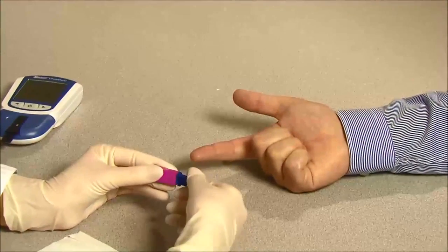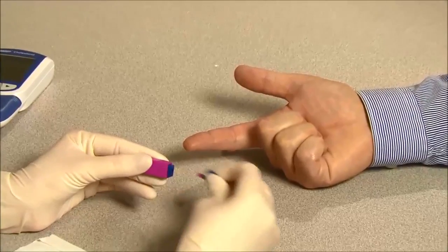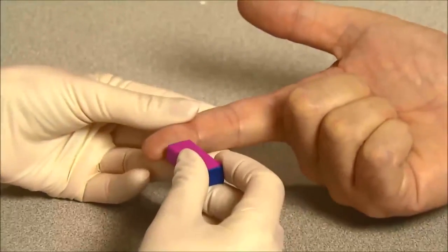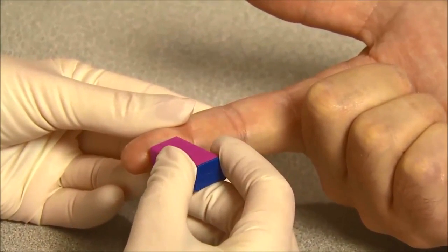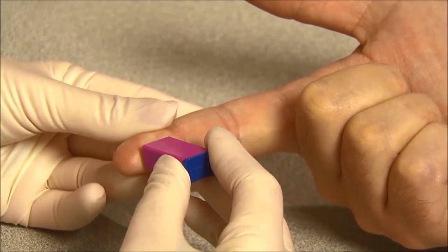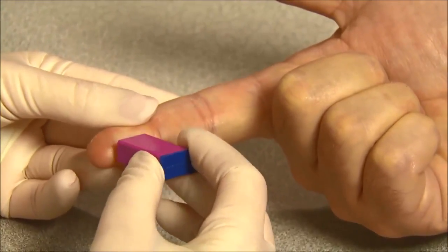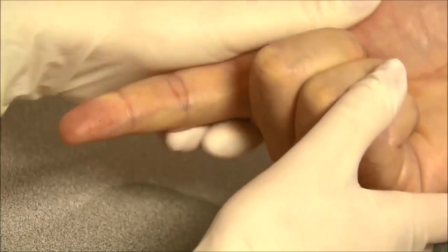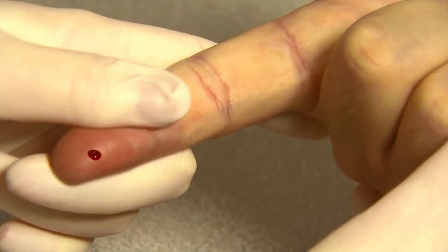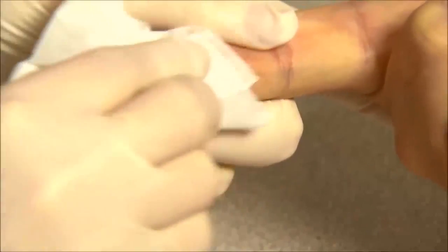Carefully rotate and pull off the protective cap. Hold the lancet firmly against the puncture site. Press the lancet against the puncture site tightly to lance the skin. Gently massage the surrounding area toward the puncture site to collect the required blood volume. Do not excessively squeeze the finger. Wipe away the first drop of blood.